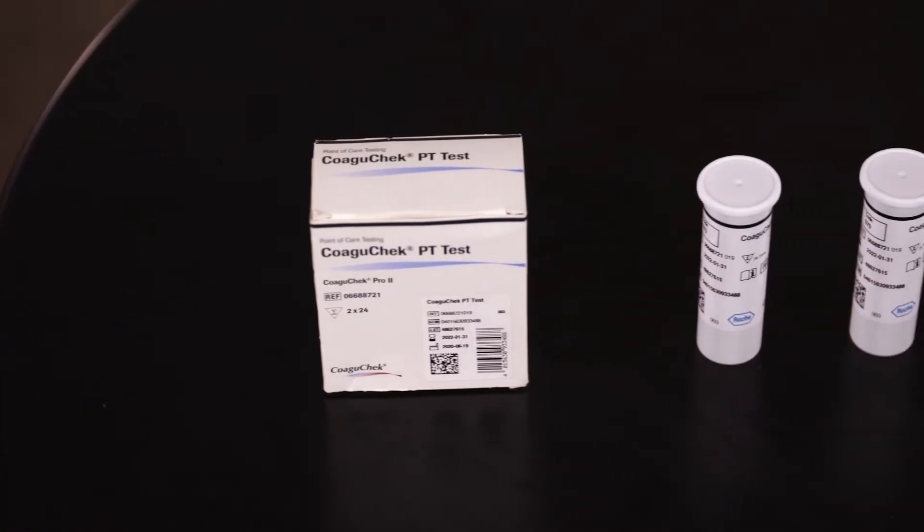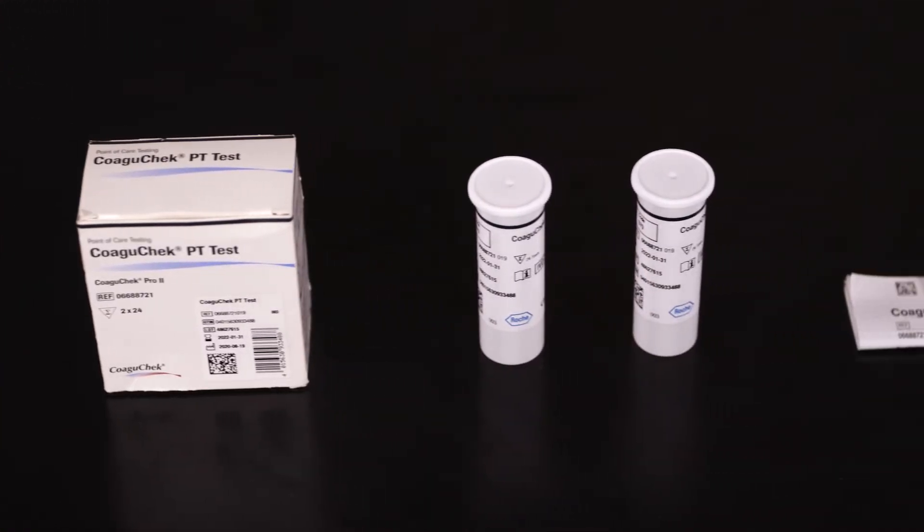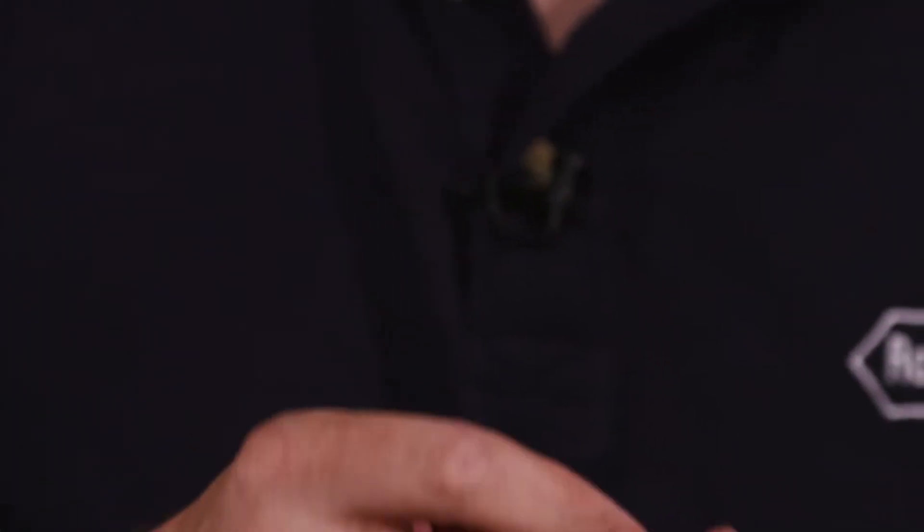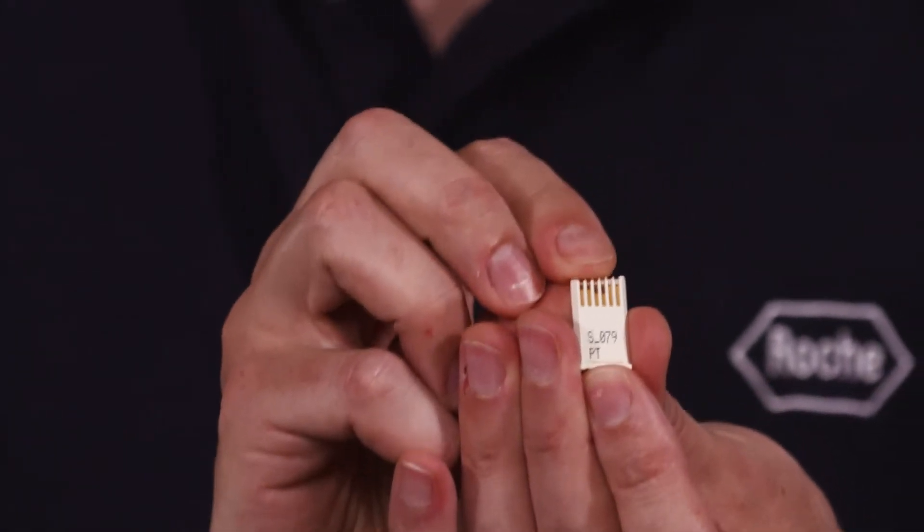Inside the box of strips you will receive two pots of 24 strips and a pack insert. Please ensure you read the pack insert thoroughly as it does list limitations and contra indicators, and also an individual code chip that will match the number on the pot of strips.